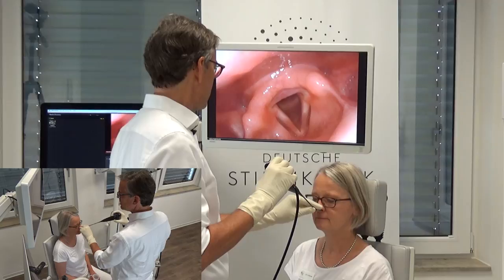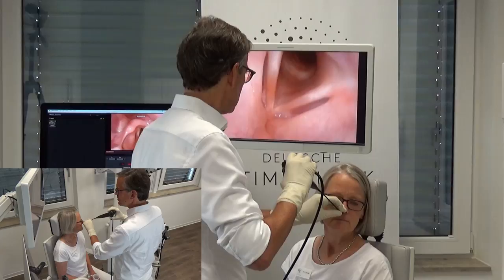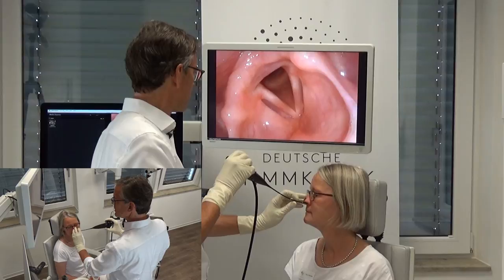What is interesting is that if I want to see the left vocal fold, I turn her head to the left and ask her: give me a long inspiration. And back. Now for the right vocal fold — give me a long inspiration.